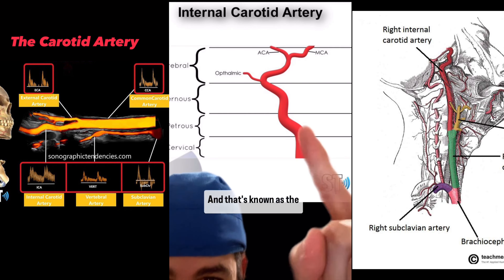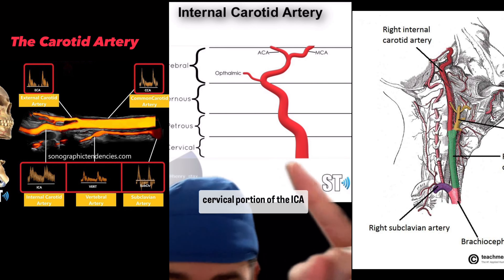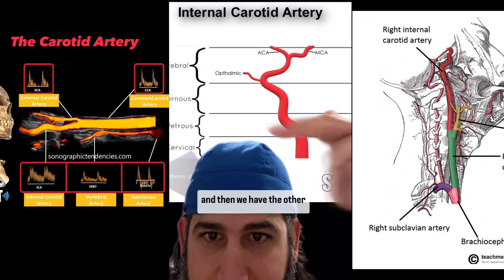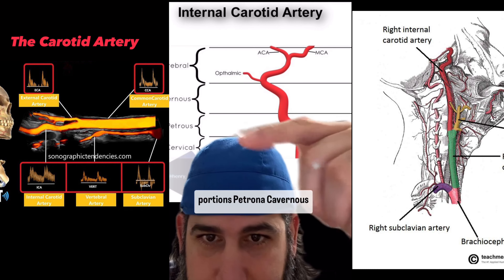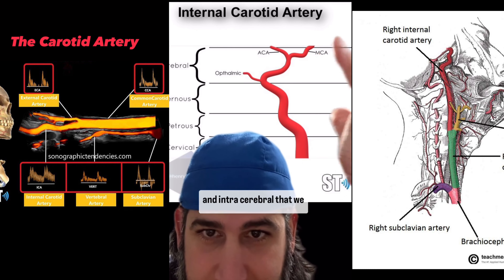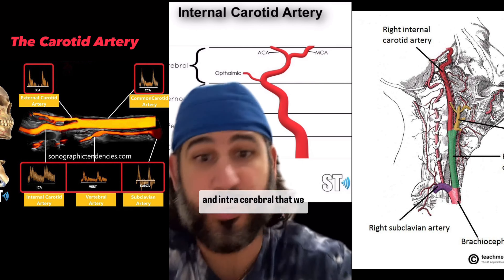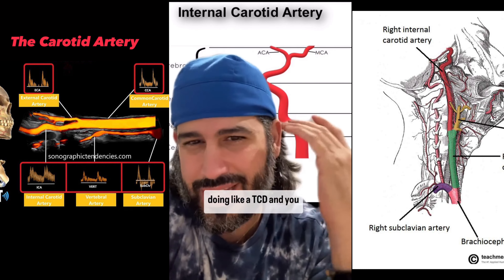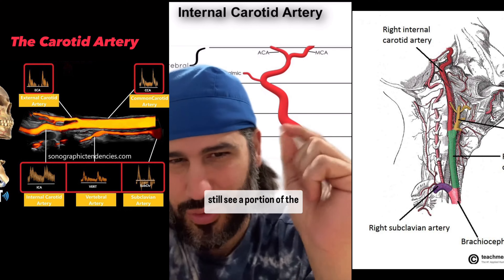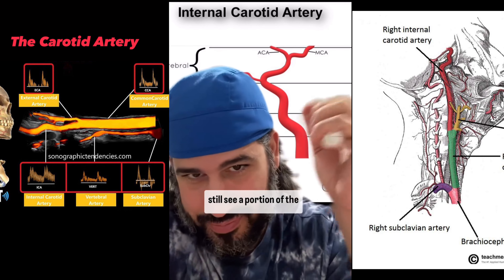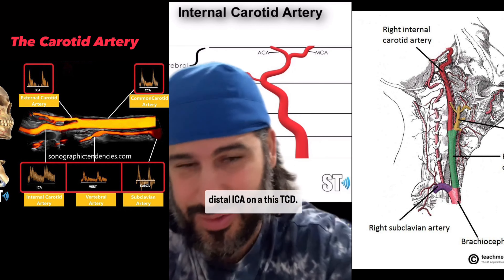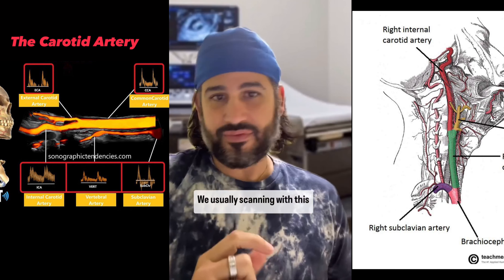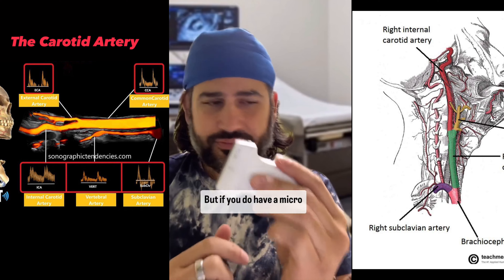That's known as the cervical portion of the ICA. Then we have the other portions — petrous, cavernous, and intracerebral — that we just can't see with ultrasound. So unless you're doing a TCD, and you still only see a portion of the distal ICA on a TCD, we're usually scanning with this probe.